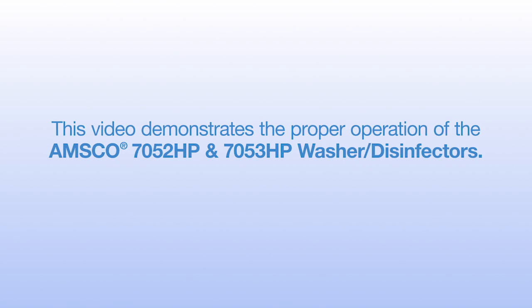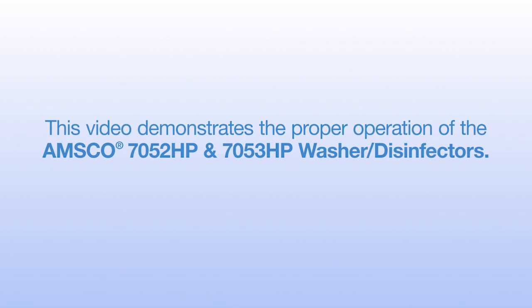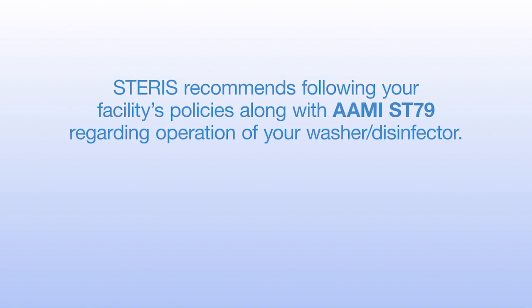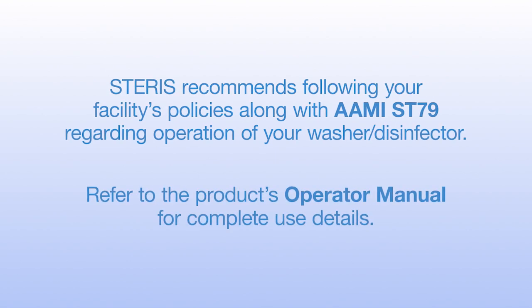This video demonstrates the proper operation of the AMSCO 7052HP and 7053HP washer disinfectors. Steris recommends following your facility's policies regarding operation of your washer disinfectors. Refer to the product's operator manuals for complete use details.